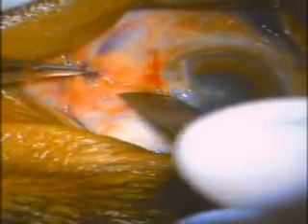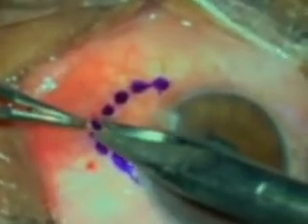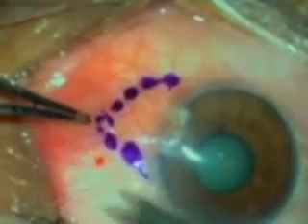Peribulbar anesthesia is given. The pterygium site is irrigated with trypan blue. It has two advantages. First, it stains the epithelial surface and hence allows for easy identification of graft site. Two, incisions are well made out due to pooling of the dye over the incision. Using a marker pen for marking incision is time consuming and cumbersome. Also, availability of trypan blue is not a problem as it is routinely used in cataract surgery.